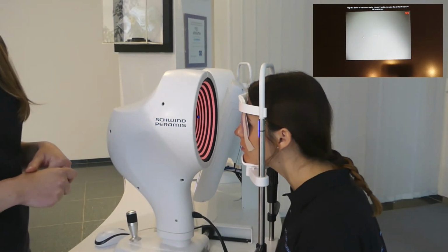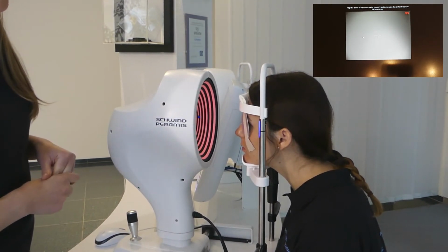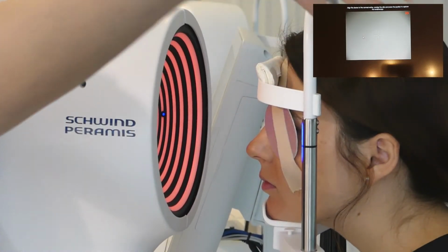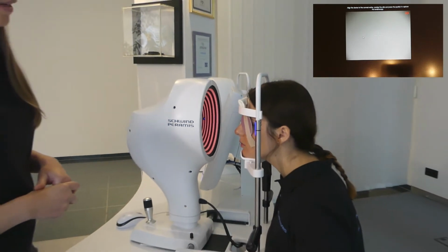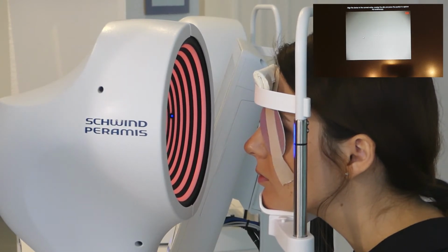Furthermore, I tilt the head of the patient. Now I'm measuring the right eye. Therefore, I turn the head of the patient to the left side, and this is beneficial in case your patient has a bigger nose to avoid the shadow coming from the nose of the patient. Now you see the head of the patient is tilted to avoid shadow that comes from the orbita or the eyebrow.